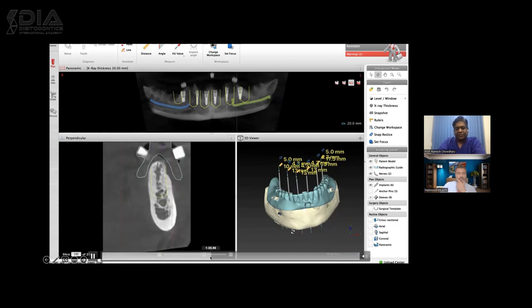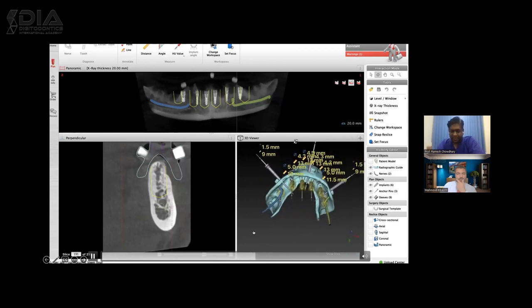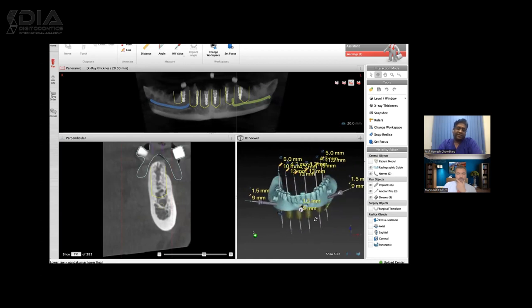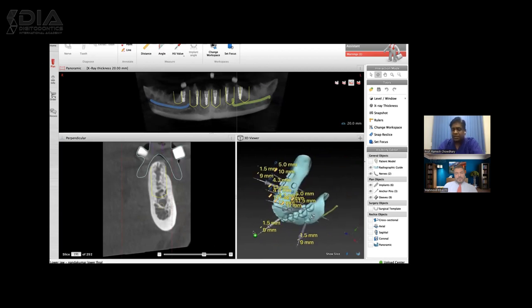And I'll just push it a little forward, and these are the pins which can be incorporated in the denture itself. So what happens is, of course, this is just one step to show how your implants are parallel to each other. This was an amazing thing because we could plan everything. We still do this regularly sometimes, where we can plan the parallelism of the denture implants and how they are opening up, where the openings of the implants are coming, especially in comparison to the teeth.